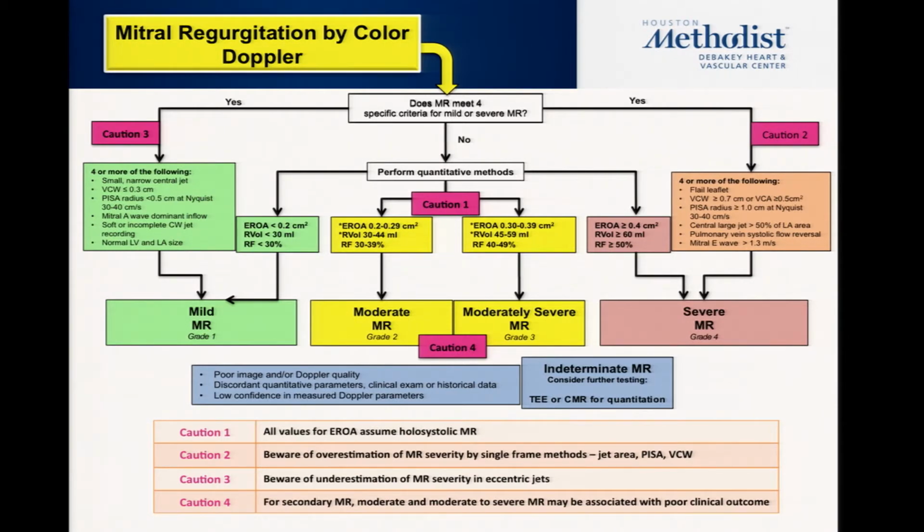The quantitation is the same. The prognostic importance may be different if the ventricle's sick versus the ventricle's healthy. So here we have these caveats in here that, you quantitate the same. You still have 3 big buckets, mild, moderate, and severe. This isn't the final version that's in the guidelines, but this is called moderate. But then over here, recognizing that if your ventricle is sick, moderate or moderately severe MR may have very bad prognostic implications. You don't need to be severe if your ventricle is sick.